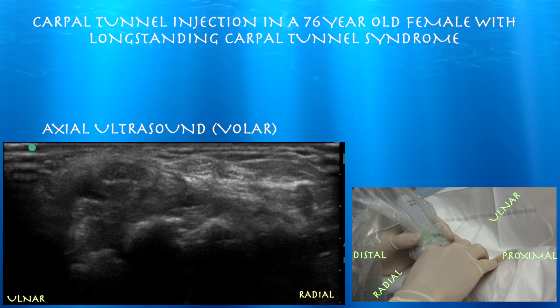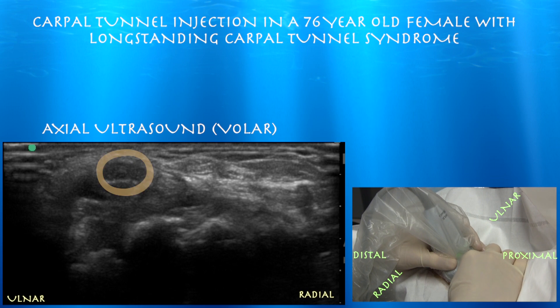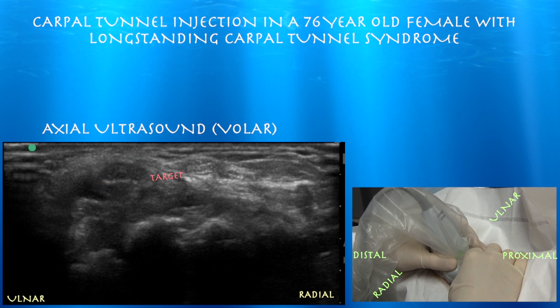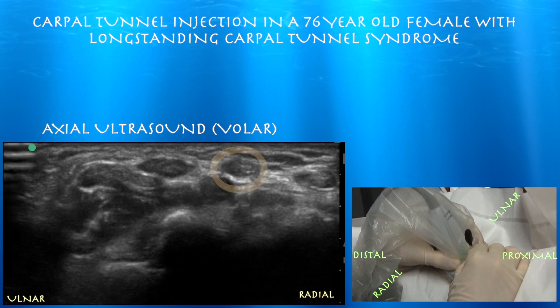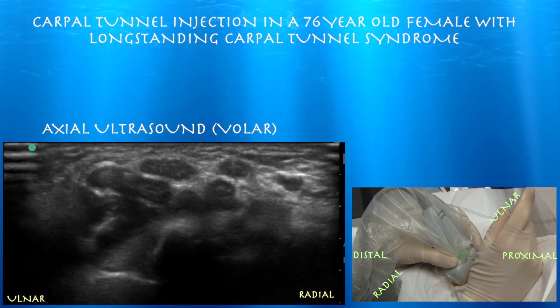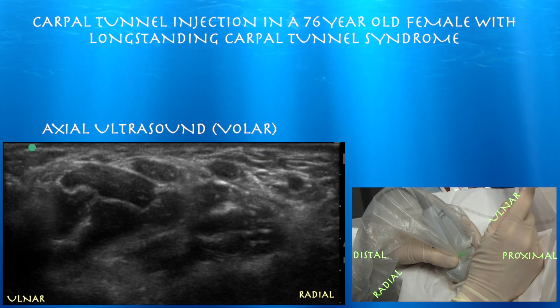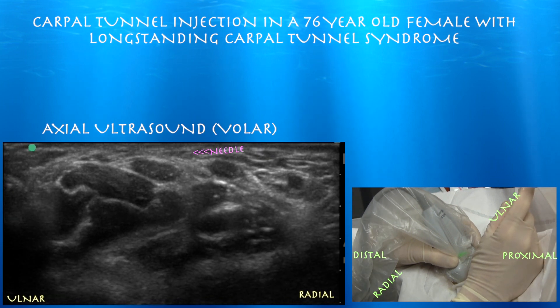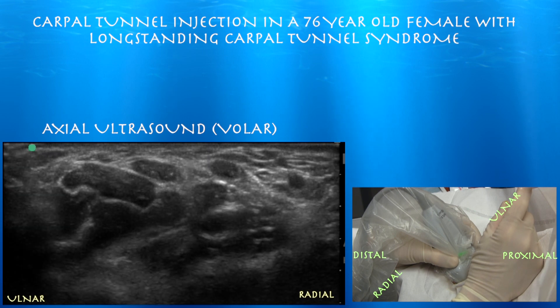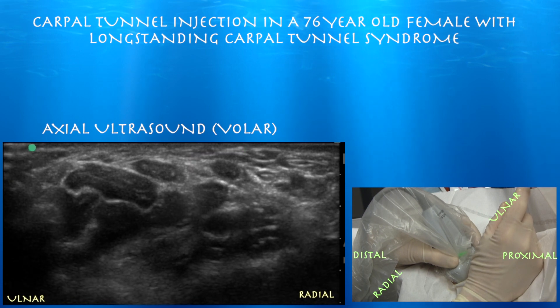We're going to do our injection, feeling between the flexor carpi radialis tendon and the palmaris longus, trying to go right to the side of the median nerve — kind of between it and the flexor carpi radialis tendon. I'm pushing right over the flexor carpi radialis tendon, so we're kind of right above the median nerve. Going a little bit radial — I don't want to go right on top of it. We're in short axis to the needle, so you don't see the needle directly, just tissue moving — but you can get a very accurate sense of where the needle is. Here it is just radial to the median nerve. Some people try to dissect it away from the retinaculum.